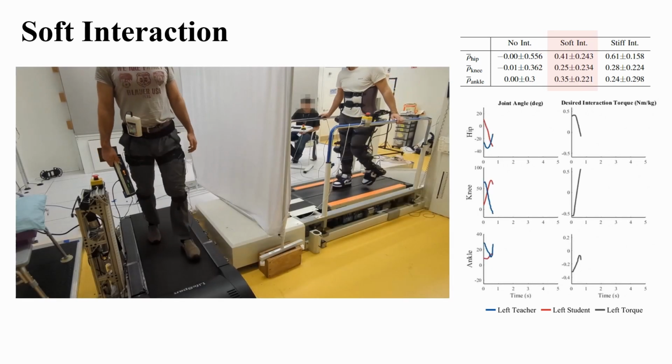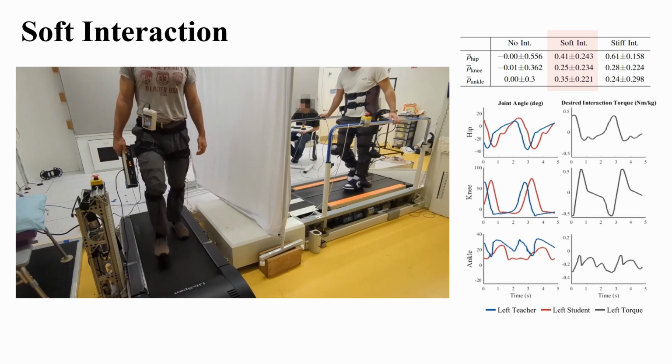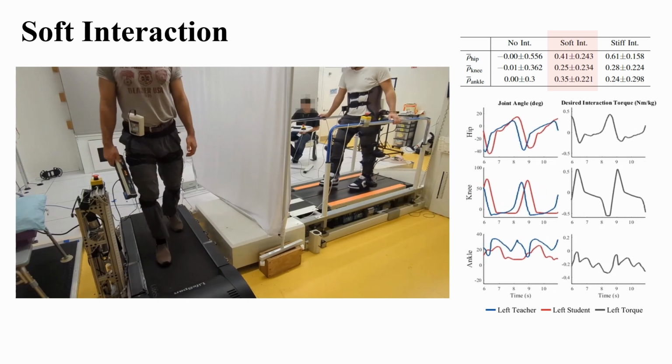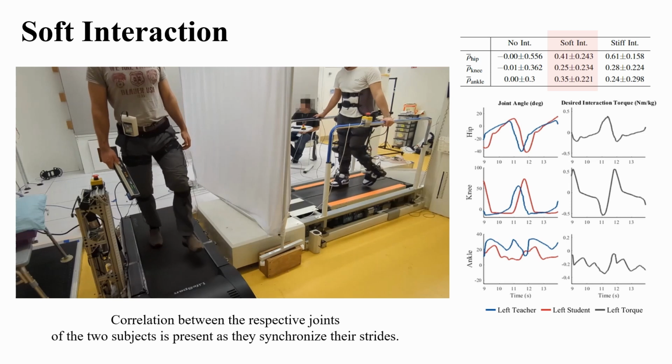In this video, we show the walking patterns of the 2 users while rendering the virtual connection. While walking, the designed interaction control commands non-zero interaction torques, which are felt by the student wearing the exoskeleton. In the soft interaction, this results in higher correlation between the joint kinematics of the 2 users, as their trajectories are more synchronized at the hip, knee, and ankle.